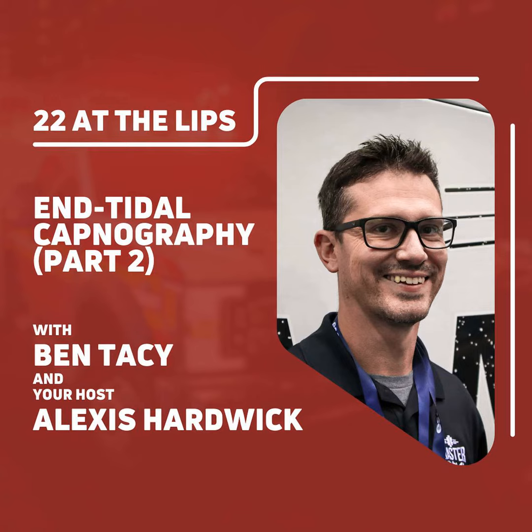I've seen that personally several times with several patients where the pulse ox looks great, the pleth on their pulse ox is fine, good readings there, but then you put them on end-tidal, and it's like, whoa, their end-tidal is through the roof. They're extremely hypercapnic. So it's a good way to evaluate a multitude of things.